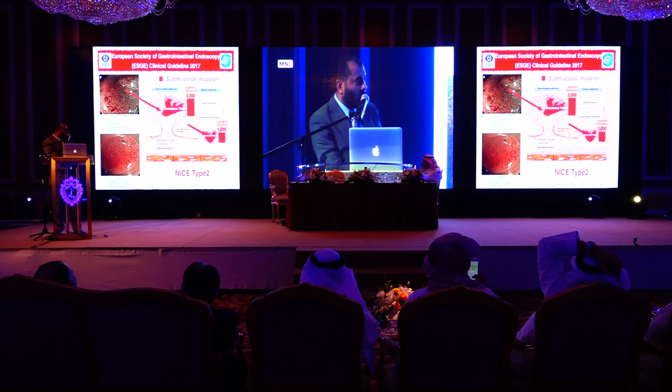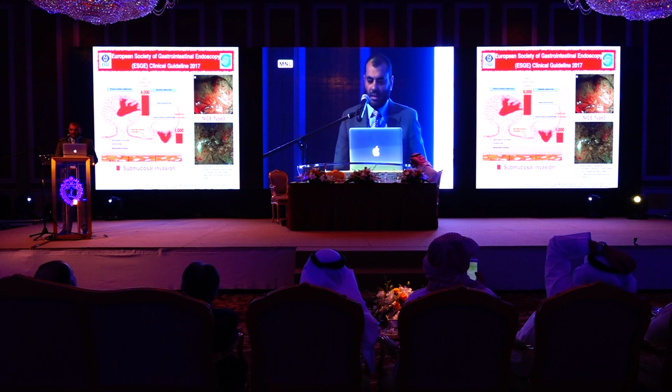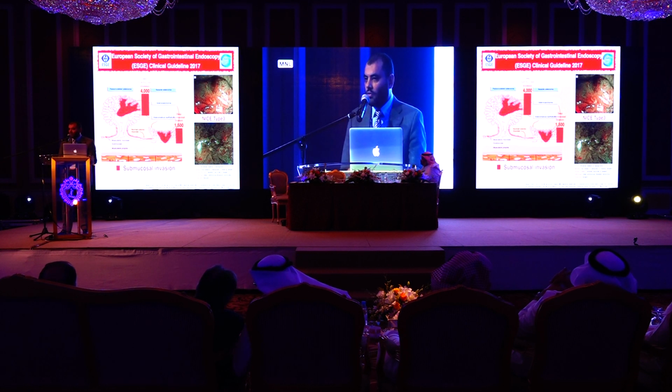If we examine this simple adenoma with intramucosal carcinoma, or even with invasive carcinoma but superficial, I'll get this view. The second view here, the upper one, shows irregular vessels and irregular surface pattern. You will see the opposite. If we see here invasion of more than 3,000 microns in pedunculated and more than 1,000 microns in sessile, this means deep submucosal invasion, and the expected lymph node metastasis is significant. There is a risk for lymph node metastasis. You should send the patient for surgery.